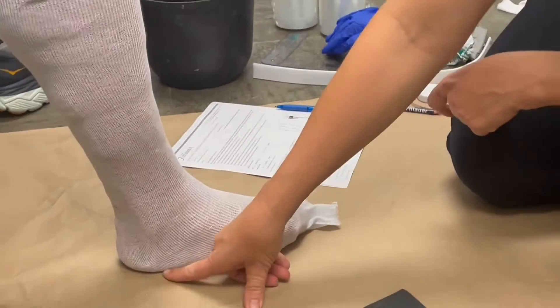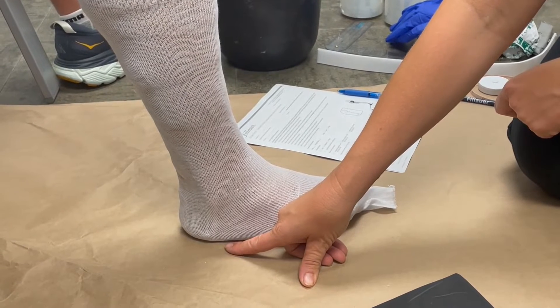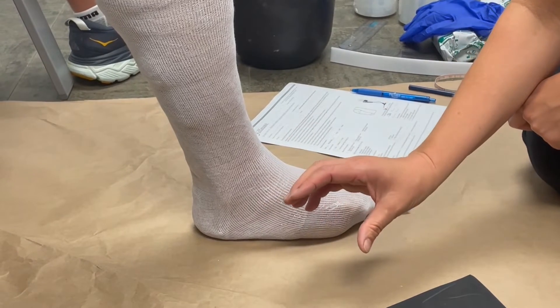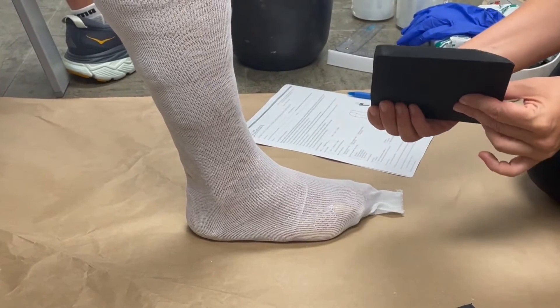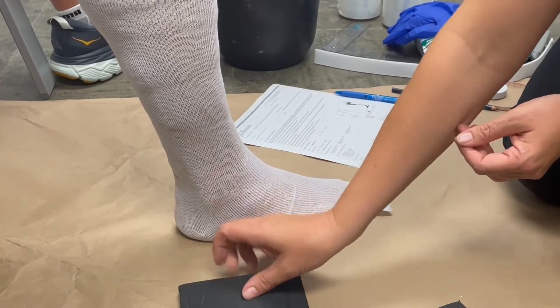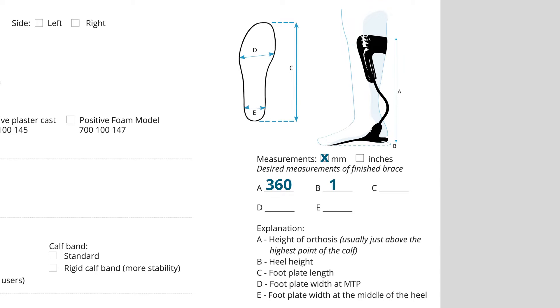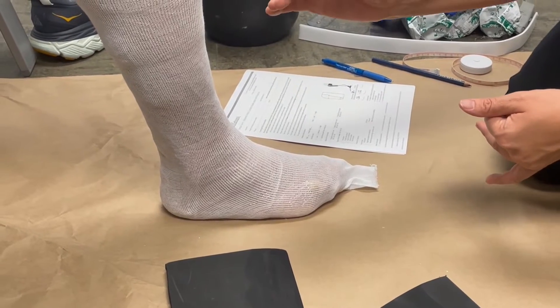I also need to know what heel height the orthosis is going to have, and that depends on what shoes the patient is wearing. You'll be able to adjust a little at fitting, but you want it to be close. Here I want a 12 millimeter heel height, so I'll put 12 millimeters at the B measurement on the form.